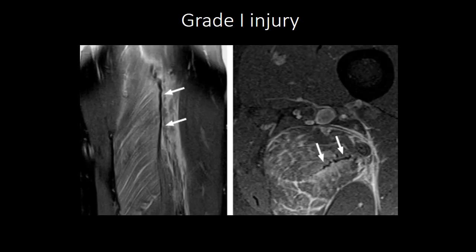This is a grade 1 injury of the semimembranosis muscle. There is diffuse muscle edema giving a feathery appearance. The tendon at the myotendinous junction appears continuous, of normal caliber, and shows uniformly low signal intensity. There is a mild degree of perifascial edema. No obvious discontinuity or disruption of the muscle fibers is visible.